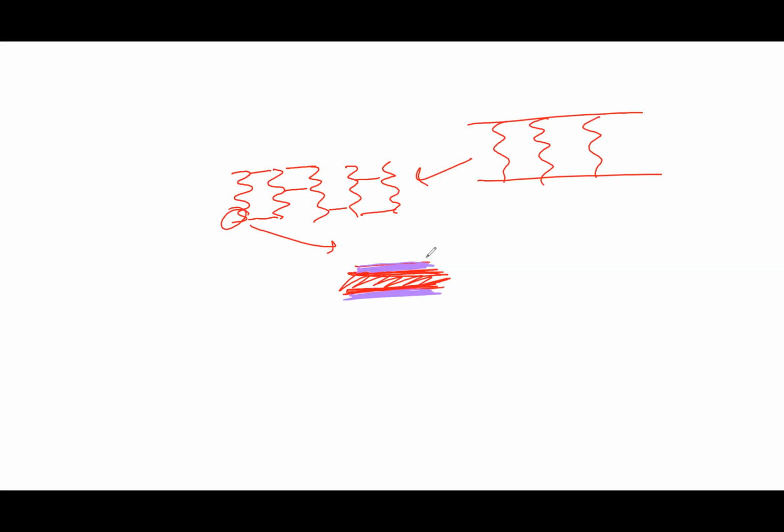And why do we put the polymer on it? Because this is where the drug will get absorbed. So this is the luminal side, and this is the abluminal side. So a question for you all: which side is more important to have the drug on? Anybody?